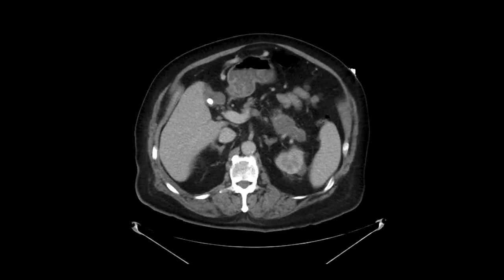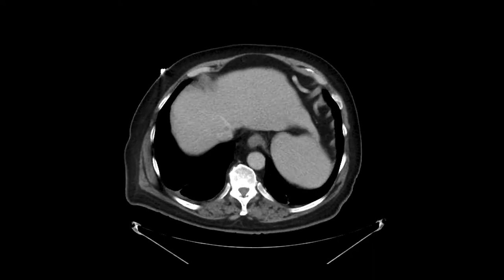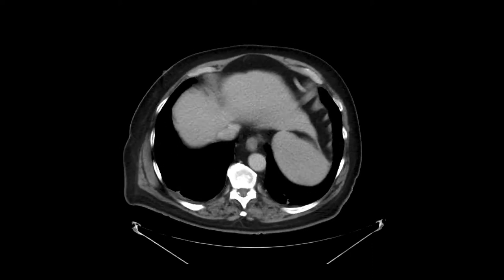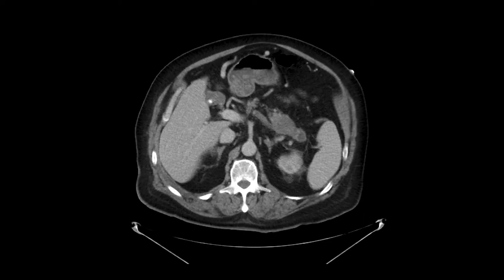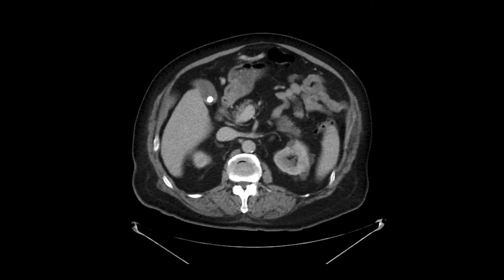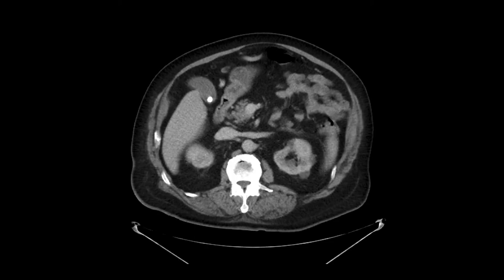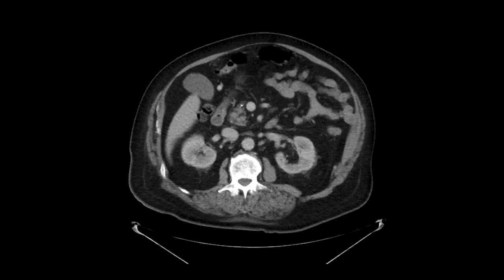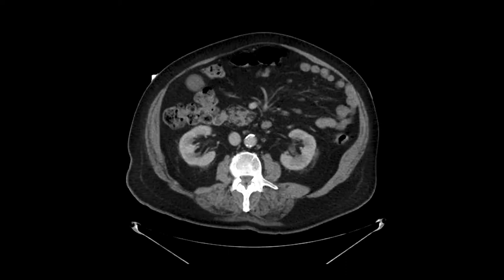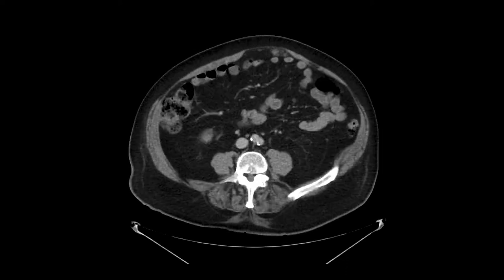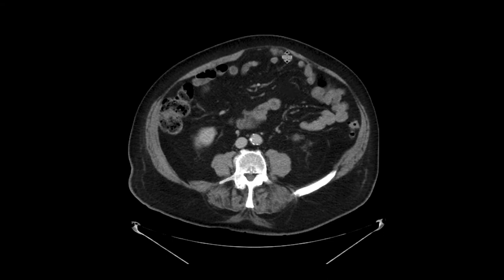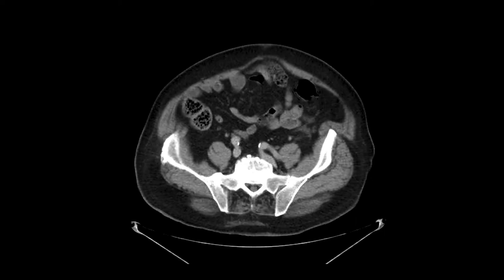Whenever we see a pancreatic adenocarcinoma, it's always good to look for evidence of metastatic disease. Adenocarcinomas in the pancreas tend to go to the liver. The liver in this case looks pretty clean. The other place it tends to go is the omentum, so you've got to look for carcinomatosis. If you look carefully at the omentum in this case, you can see just deep to the rectus muscles, there's an implant compatible with carcinomatosis.